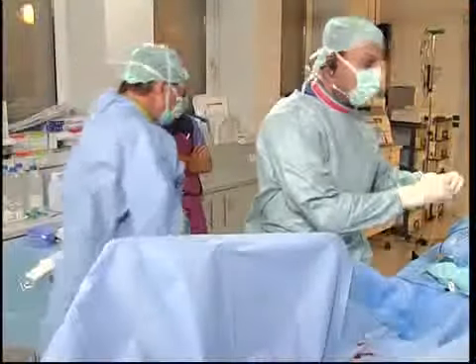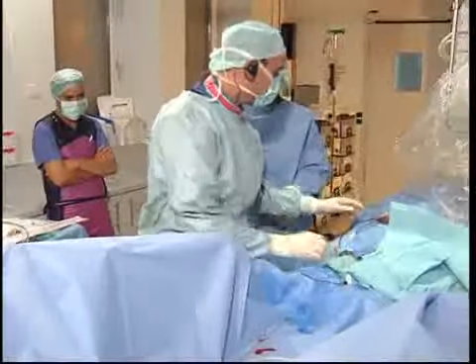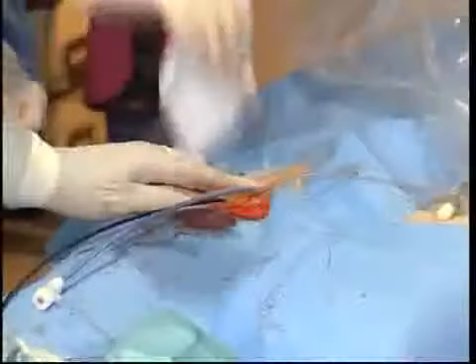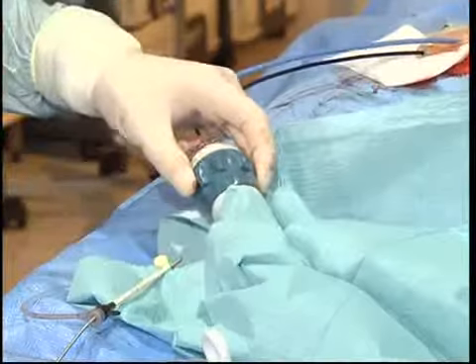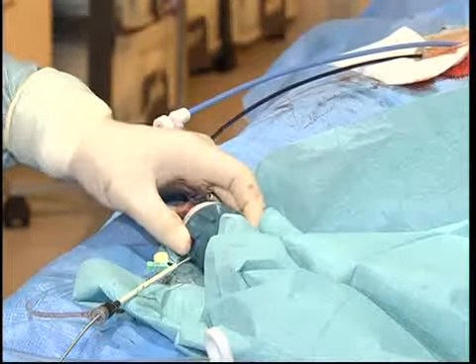That's good. So basically what we did here, this axis was somewhat a little bit difficult in this gentleman. We put two sheaths, 11 French and 10 French via two separate punctures. The 11 French for the ICE catheter. Horst has the 11 French AccuNav catheter. This is the four-way tip articulation, and then the other sheath for the device.